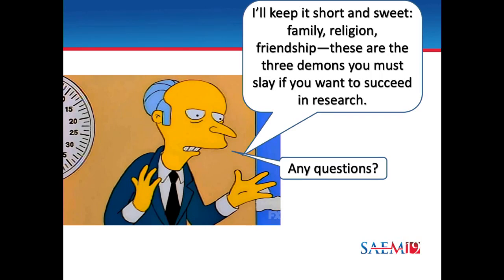Yeah, in front. How well does this work if they have AFib? So if they're controlled AFib, what you end up with in AFib is your R to R variability is all over the place, right? So you'll have an R to R length here, here, here, here. So if they're in AFib, we throw them out. We don't do it in AFib. That's an exclusion criteria. If you're actively in AFib, it's an exclusion criteria to our heart failure research for this.